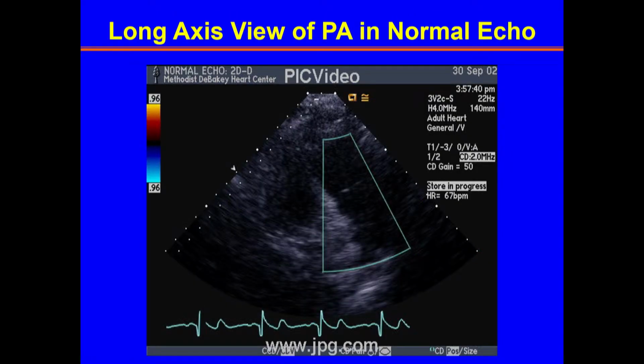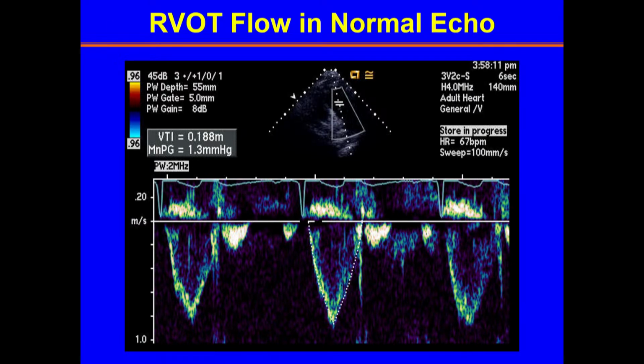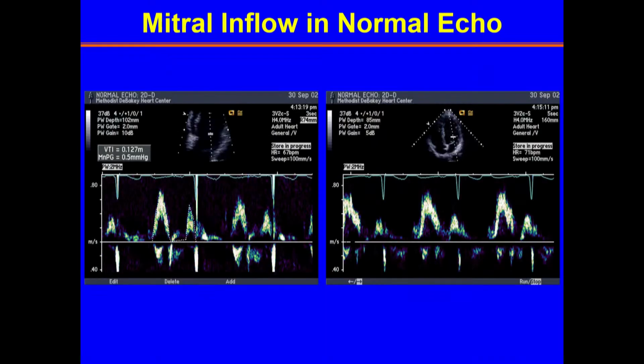For the right ventricular outflow tract, this tends to be more challenging. We can rely on a long axis view of the pulmonary artery or a parasternal short axis view at the level of the base that gets both aortic and pulmonic valves. Frequently it is possible to identify that lateral border better when you put color, so you can do that. And then again, we get the flow through the right ventricular outflow tract. Notice one closing click, and we combine them in the Doppler equation as we talked in the very beginning to get flow through the RV outflow tract.